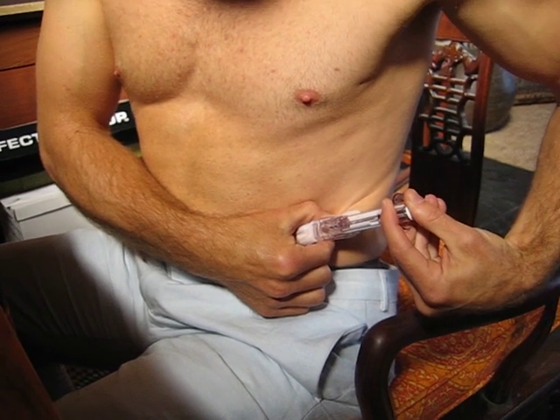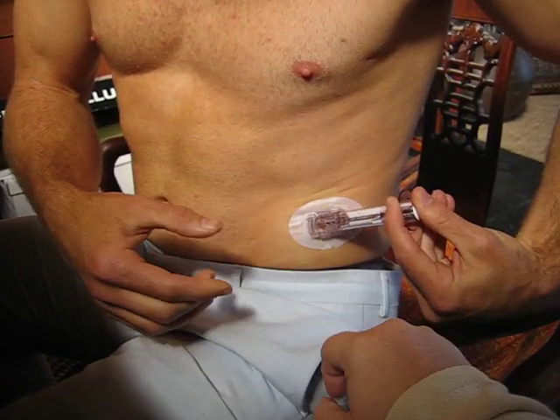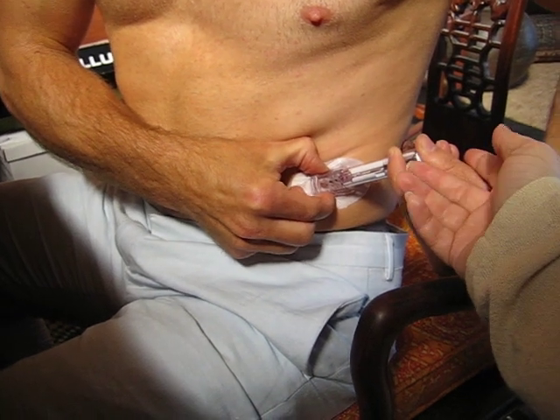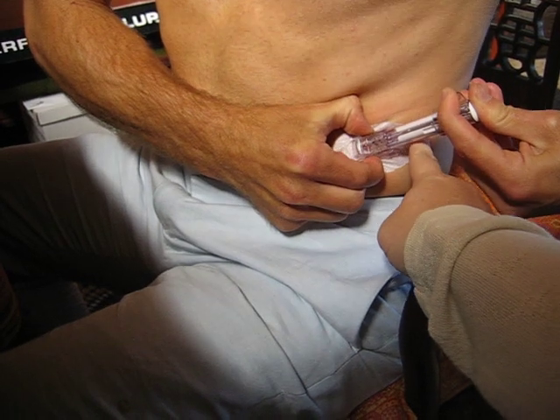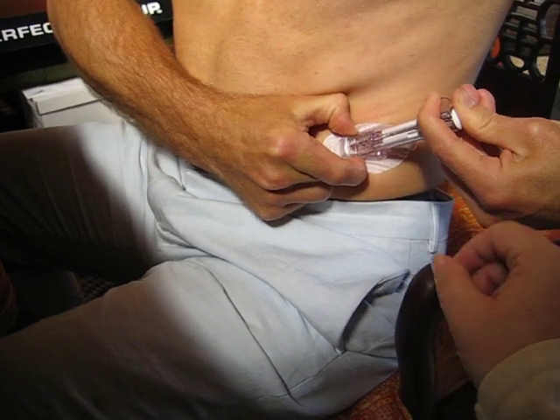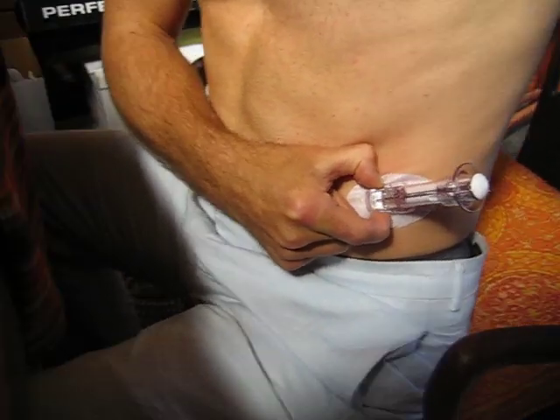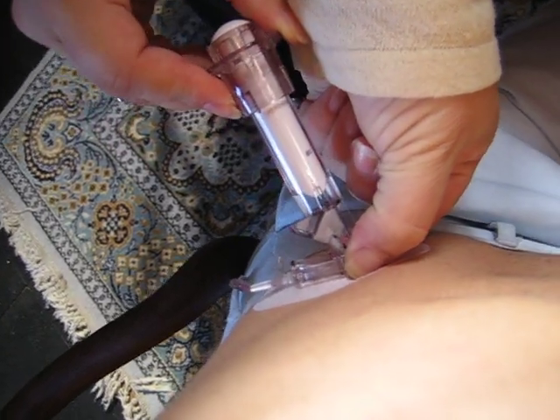Now on those sides you're going to see those little white ridges. Go ahead and release — hit those white ridges — and you're going to rock the applicator forward and out. I'm going to get you to help with this part. I was trying to slide the whole thing out, but you just rock the back out.